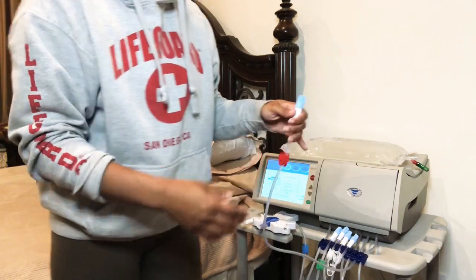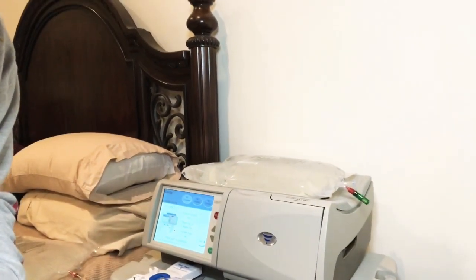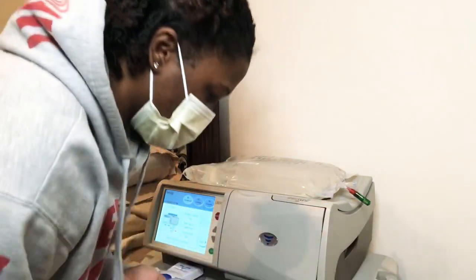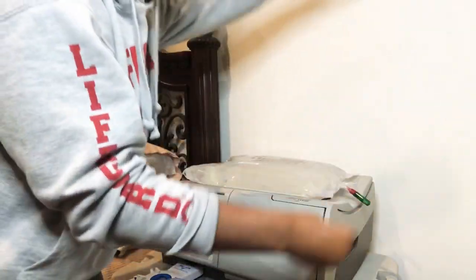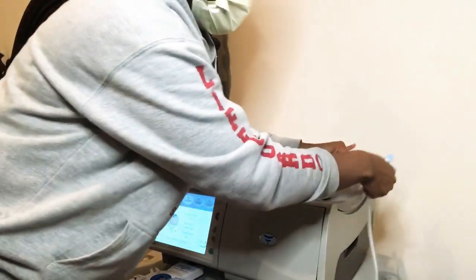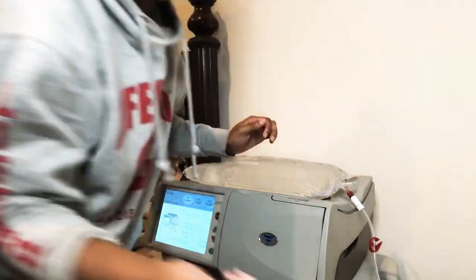And I'm going to quickly do that. Let me just kind of get you guys in the shot. So always with this, because it has to be very sterile, I just go ahead and quickly sanitize again. You definitely want to make sure you have very, very clean hands. And it's going to be one quick, smooth move. I'm going to untwist this green cap and untwist this blue and connect it. And then there you have it. Those are connected. These are garbage.